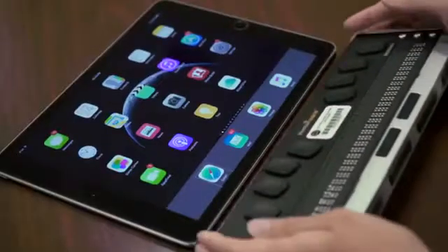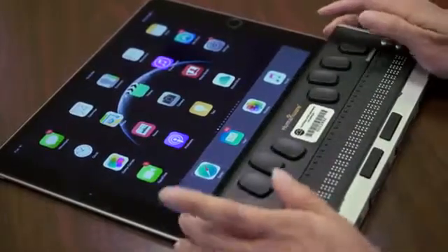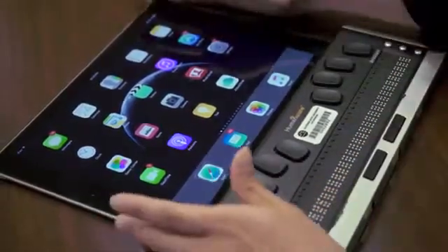The second item is the Braille refreshable display. This is how blind people read. My Braille refreshable display is connected to my iPad, so whatever I touch on here, it's also raised up on my refreshable Braille display.